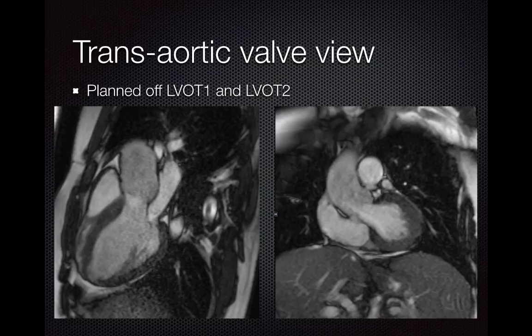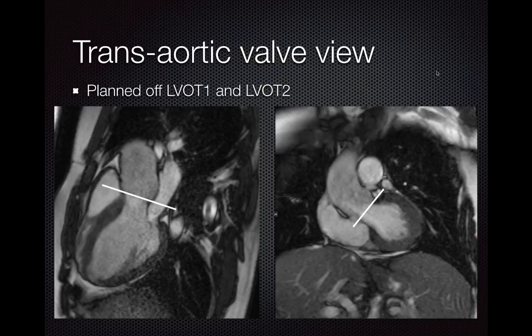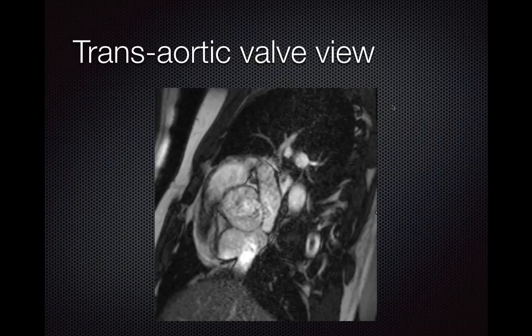Using these two LVOT views, we set up the trans-aortic valve view. This requires a double oblique view to see the aortic valve en face. We line up along the plane of the aortic valve on LVOT1 and along the plane of the aortic valve on LVOT2. This gives us a nice en face view of the aortic valve — in this case a bicuspid aortic valve with a fish mouth configuration — with the aorta and leaflets clearly visible.